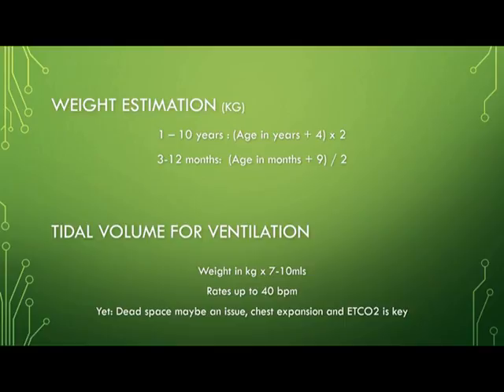During ventilation of the patient, a volume of 7 to 10 mL per kilo should be used. Remember that intubation in the neonate can increase the resistance to breathing by up to 16-fold, so ventilation is mandatory in small children. You may need to set a larger volume to ensure chest rise and fall and end-tidal carbon dioxide levels, due to a large dead space within the equipment relative to the patient's size. You may end up ventilating the equipment and not the patient effectively.